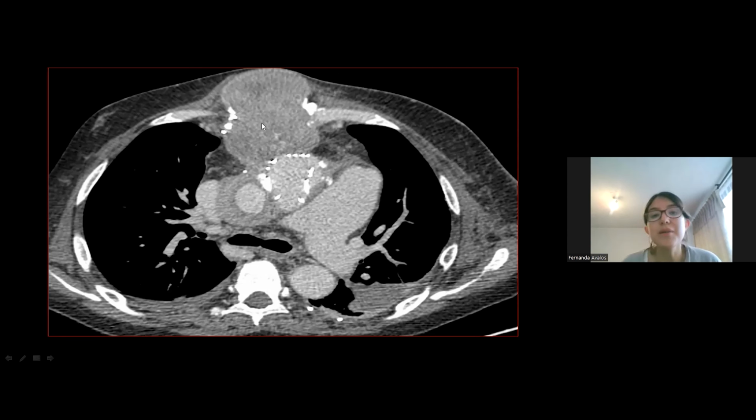Here we have the big aneurysm. The patient felt a pulsatile mass in his chest. This was a type 3 endoleak. There was a structural failure of the graft, and it was a really interesting case because, as I told you, this is more rare, and with a pseudoaneurysm it is even more rare. So this is the case I wanted to present. Endoleaks are sometimes difficult to understand, but we just need to go to the classification to organize our mind on how we need to search.